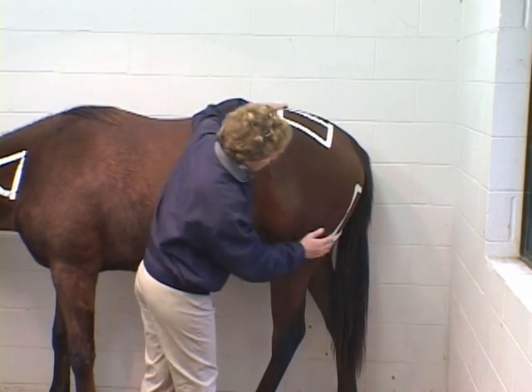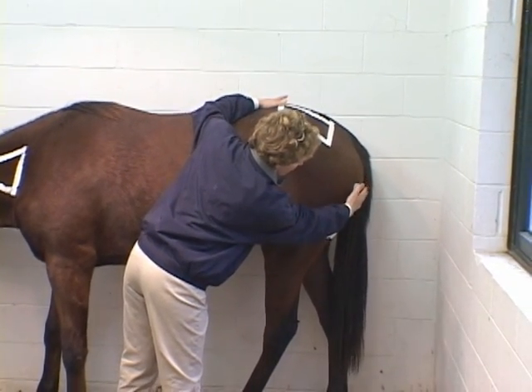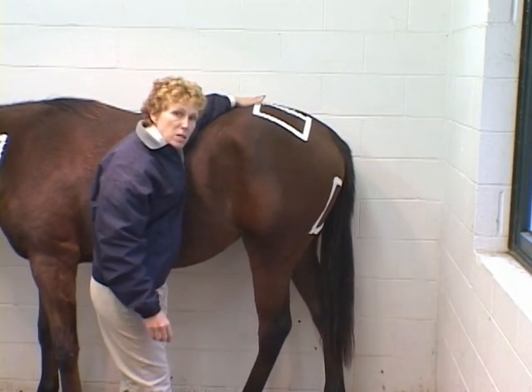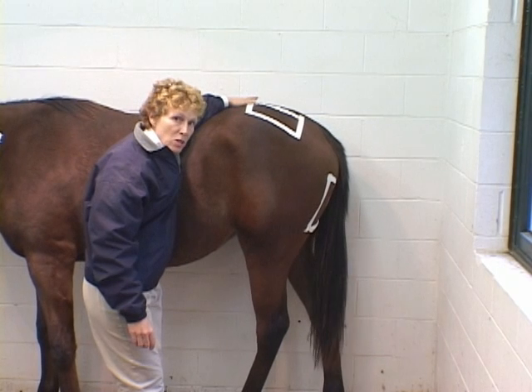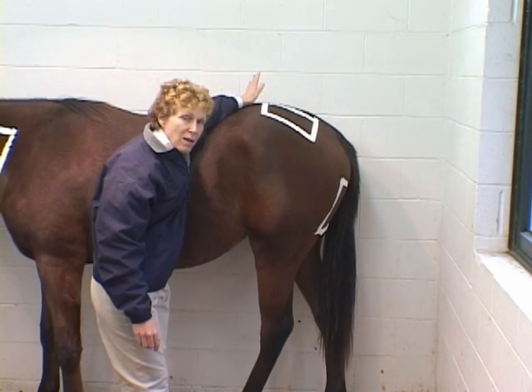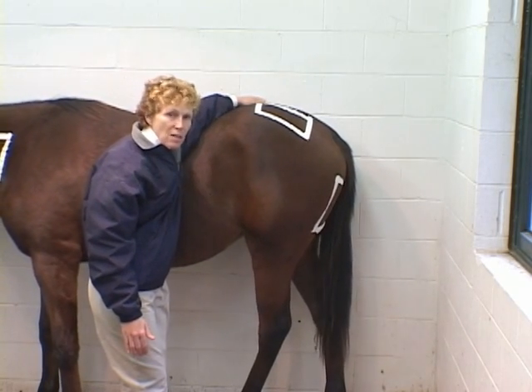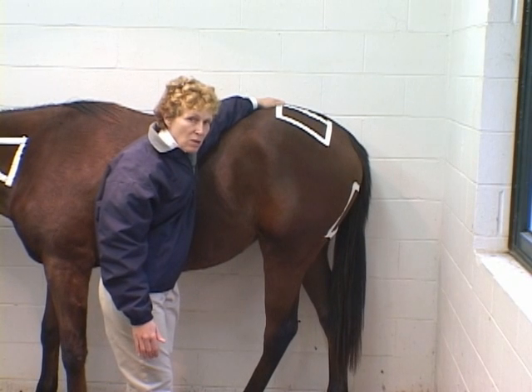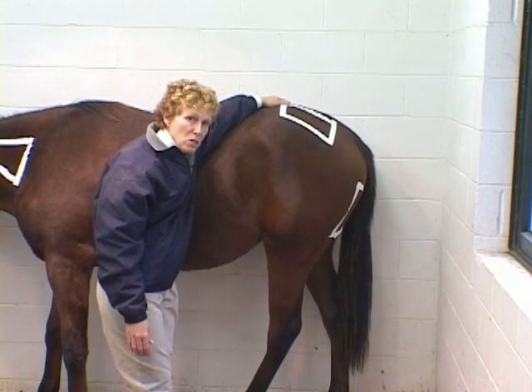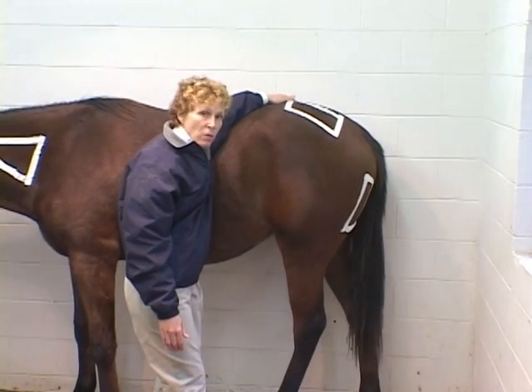Your third choice would be over the semimembranosus and semitendinosus, right there on the very back side of her rear end. There's lots of muscle mass there — a nice place to give an injection. But as you can see, I'm poorly located in terms of inflicting a little bit of pain on her, and I'm certainly going to need somebody hanging on to her head. It is well set up in terms of having drainage if you got an injection abscess or myositis.